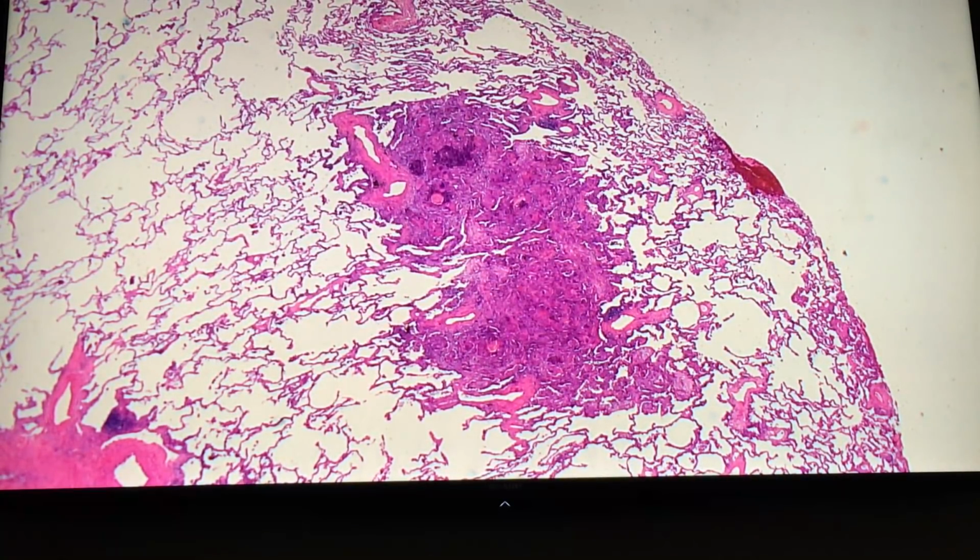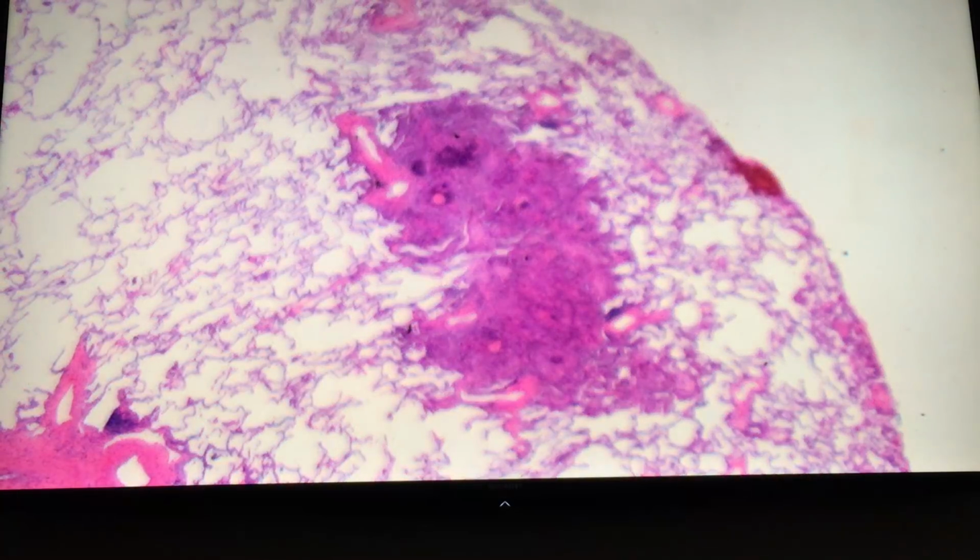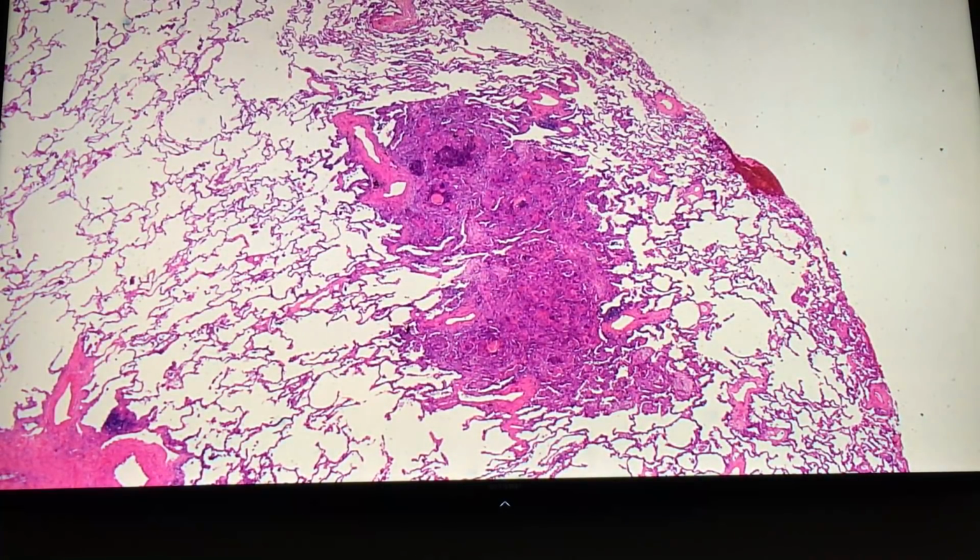Anybody, can you tell me what? Bronchial or? Yes. How do you know that? I don't see a bronchiole here. Blood vessel is here. Yes, that's a great point. I am proud of you for saying that. That's very, very good. So the point is that because you see an uninvolved blood vessel, there must be an involved bronchiole next door. So just point out the blood vessel, Aaron, at the top left.